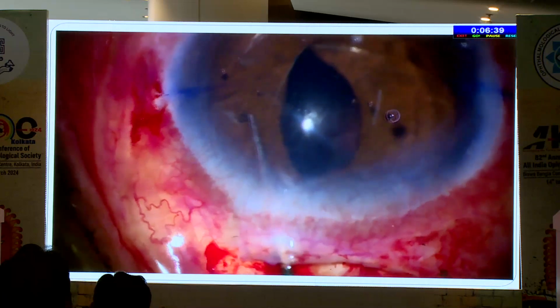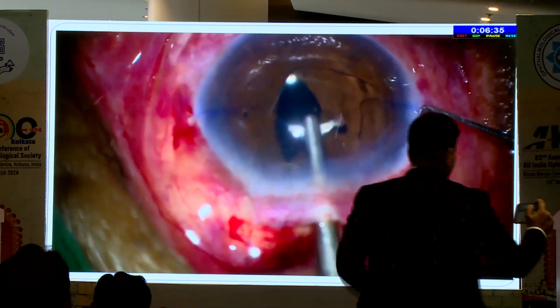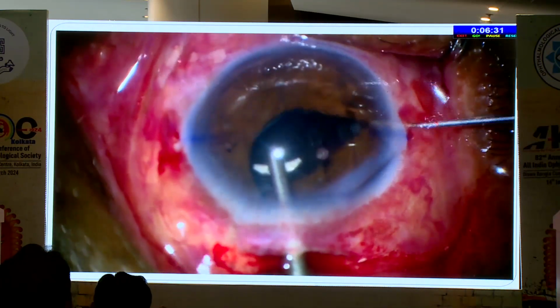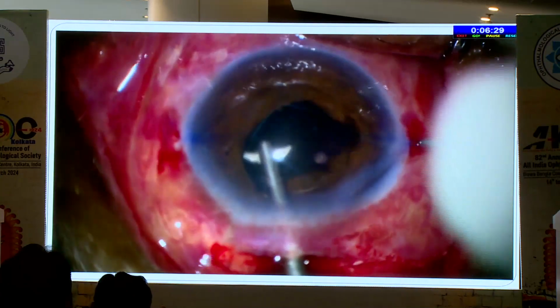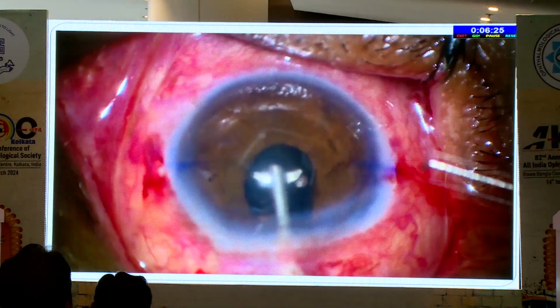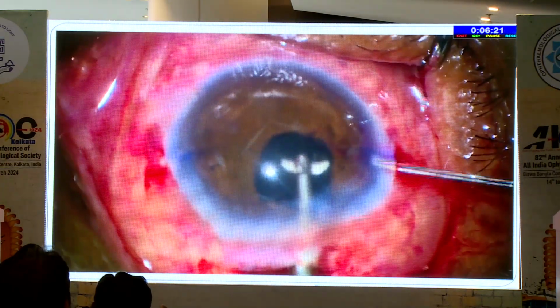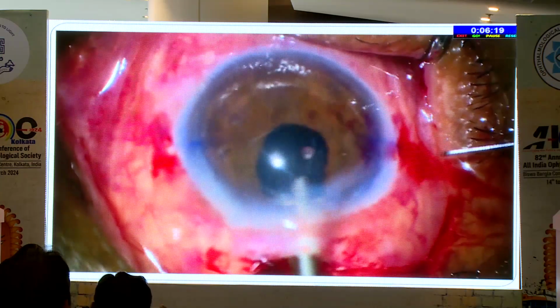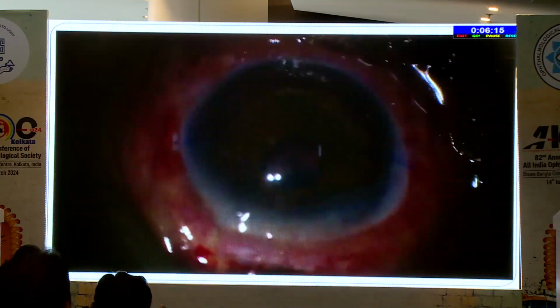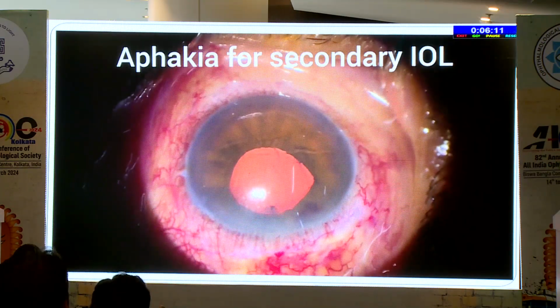So this confirms that the enclavation is proper and it will not come out. Similarly, on the other side, the haptic is gently slid below the iris tissue, and then the lens can be lifted up a bit so that we can see this indentation on the side, so that we know where the notch is. Then with a single click, we can just place the iris claw lens in place, and the pupil is well round and circular at the end of the case.